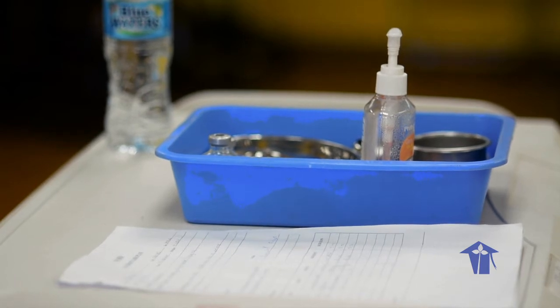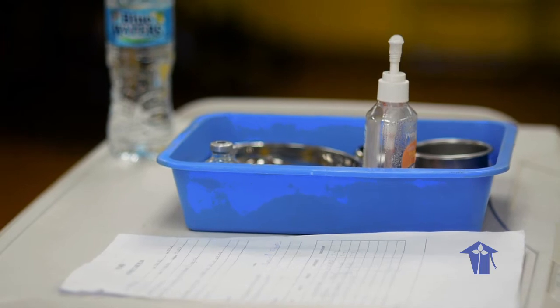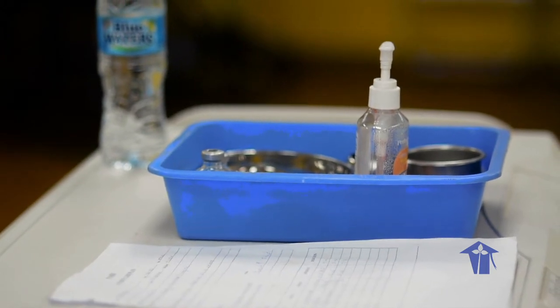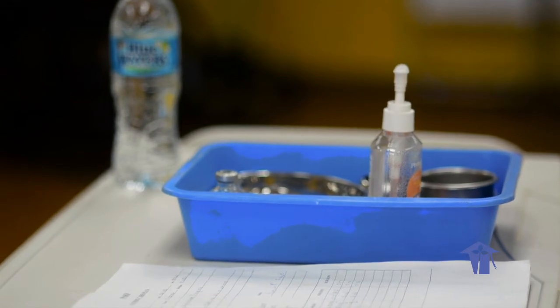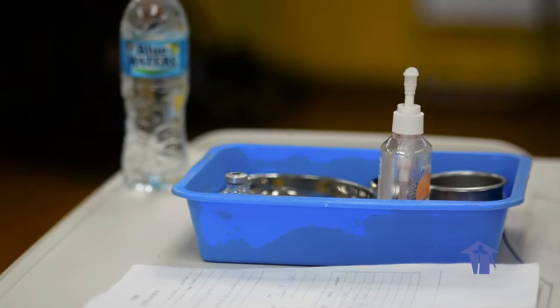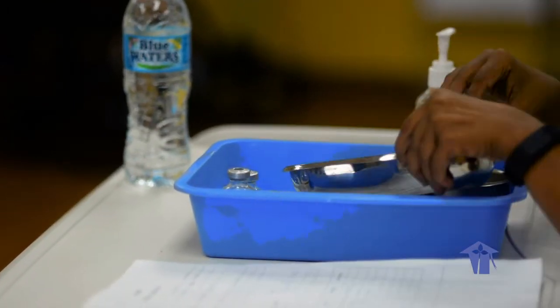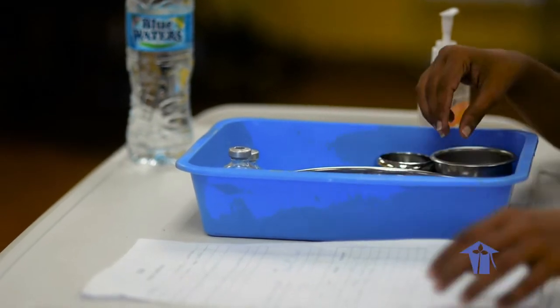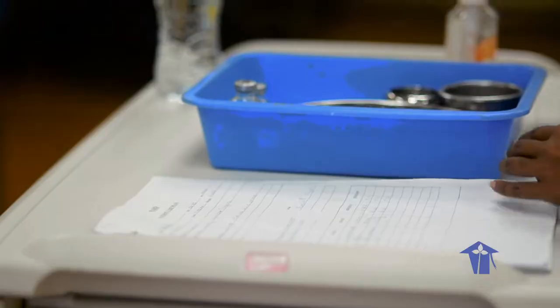Always complete your assessment before administering medication. You would gather your equipment, which is additional PPEs if needed, medication, the sterile syringe and needle, sterile swab, your doctor's notes and your nurse's notes. You would perform your hand hygiene.